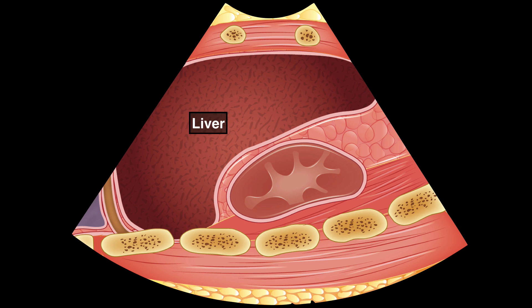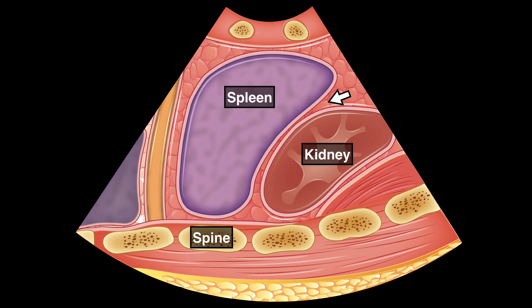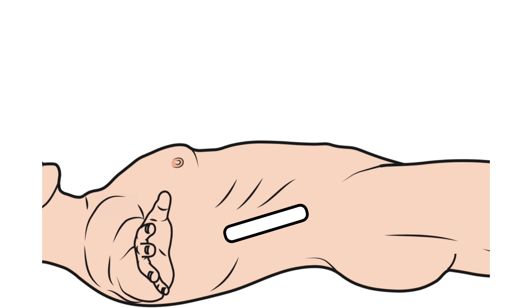For the bladder, sagittal view with indicator towards the patient's head, and transverse view with indicator towards the patient's right side. Similar to our FAST exam, on the right we note the liver, kidney, Morrison's pouch, spine, and diaphragm. On the left we note the spleen, kidney, splenorenal space, and spine. These are similar imaging planes to the FAST exam, but now rather than focusing on free fluid in potential spaces, we're focusing on the kidney itself.